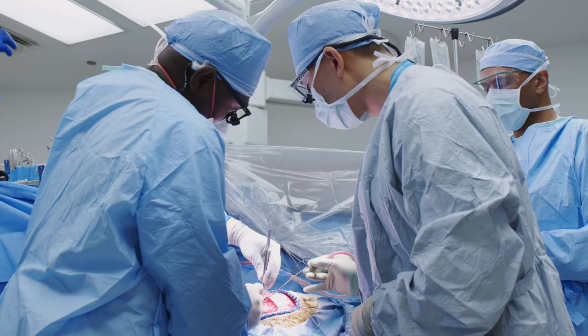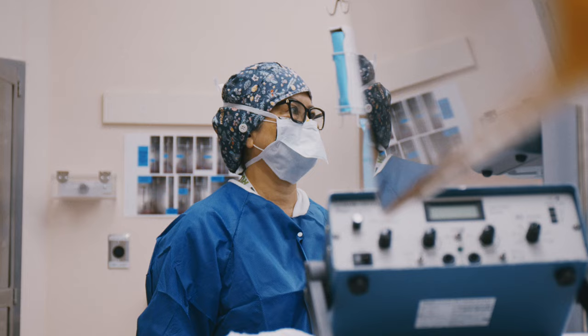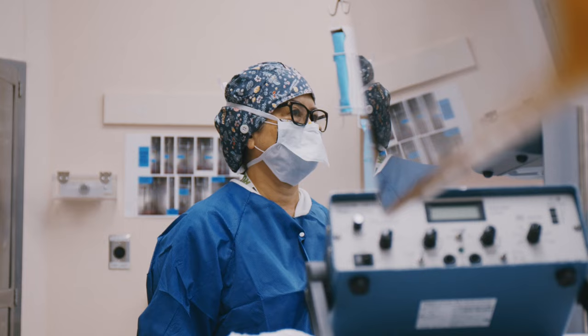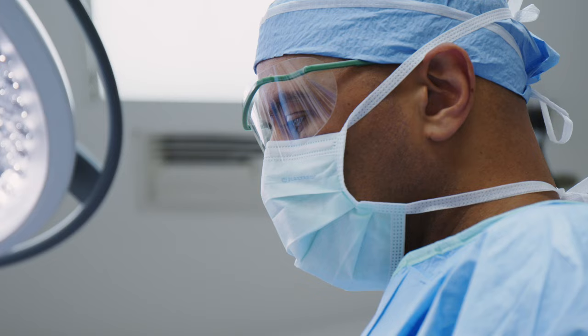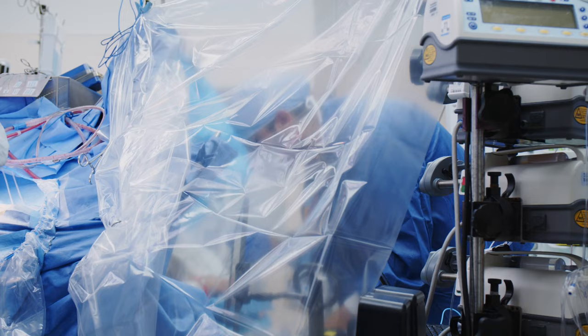Of all the medical procedures that a patient can have, an awake craniotomy is probably the best example of a patient-surgeon-provider collaboration. Throughout the entire surgical procedure, the surgeon and the entire surgical team has to listen to the patient. We actually set up the drapes in the room so that as many eyes can see the patient as possible.